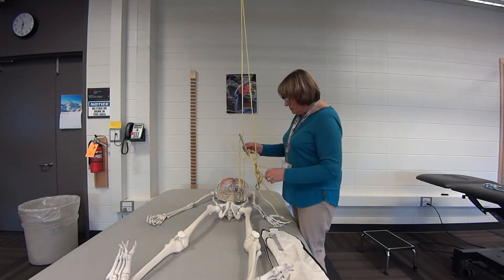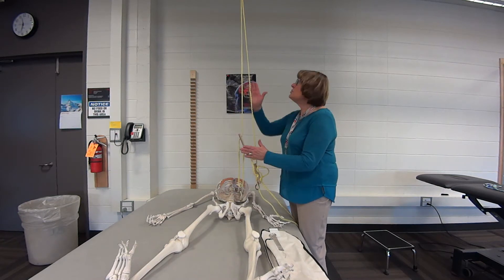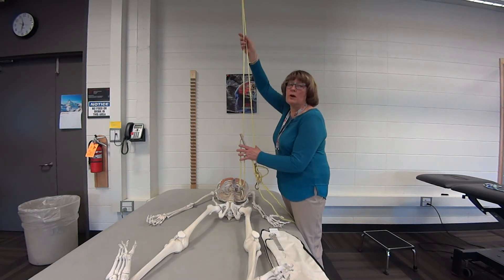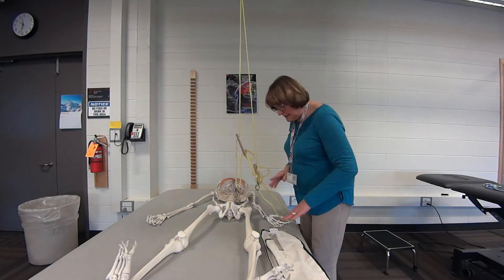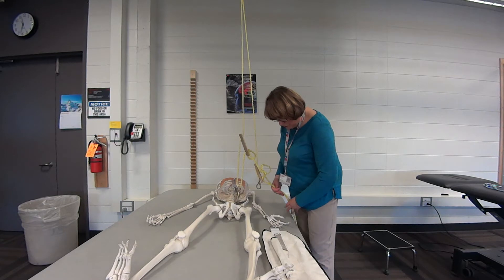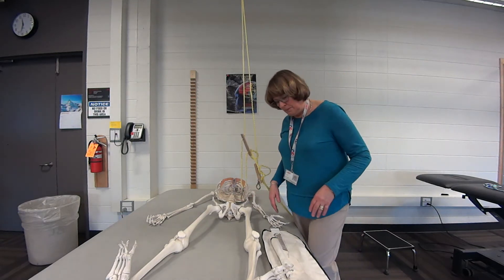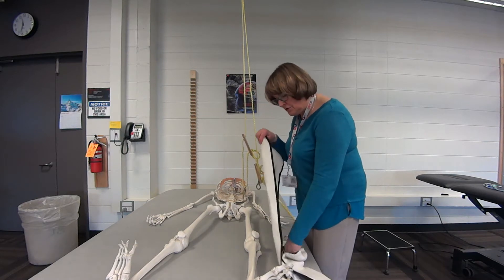You want to make sure this is in the right place. You can alter it by changing where your S-hook is on the grid. Then make sure the strings are off the edge so they're not hitting the patient. Then get your slings ready.